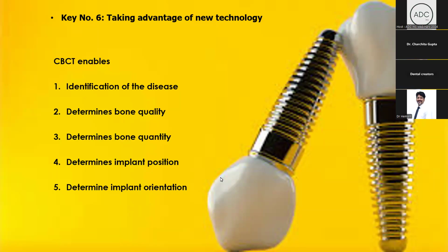Or it's going straight, or we are not near to any vital structure also. So in this way, CBCT helps in the orientation of the implant. Now, the second option which CBCT software provides us is that we can also plan the process.